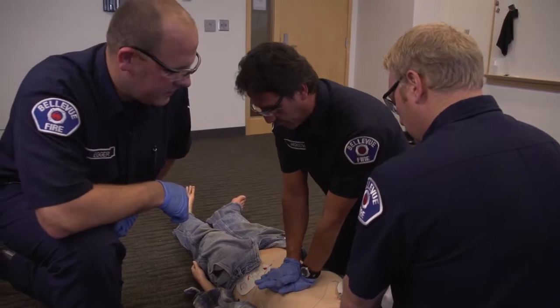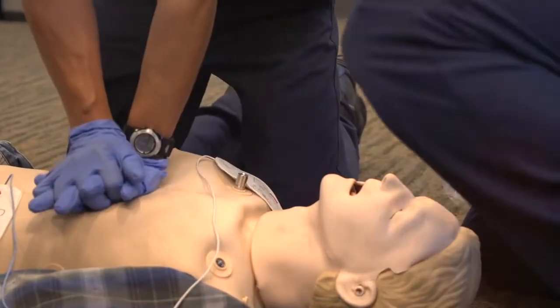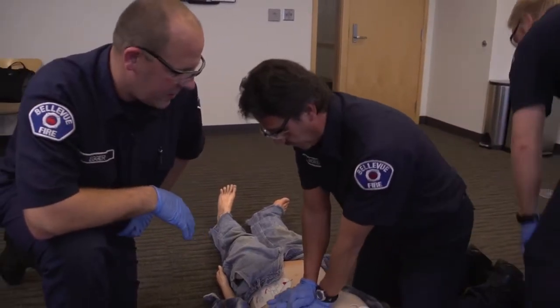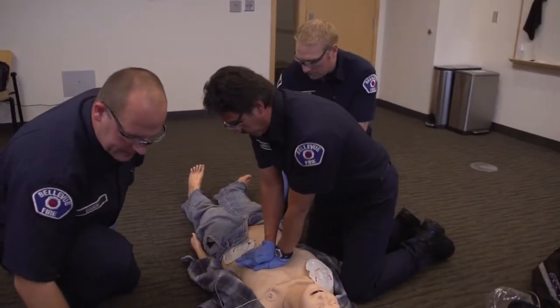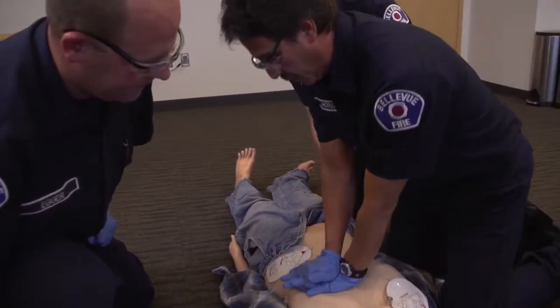26, 27, 28, 29, 30. One. Two. After this set we'll analyze. Mario, stop CPR. Stay clear — have a strong femoral pulse with CPR. Begin CPR.